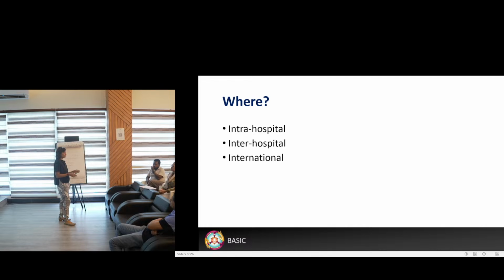Okay, great. Equipment, what do we need? A portable monitor. Yes. With battery, because we don't have a power point along the way, so we have to have enough battery. Okay, what else? Sorry? Oxygen. How much oxygen? I know Maynard, who's just walked out, so there's a calculator. Oh, there he is at the back. Do you know how much oxygen we need?